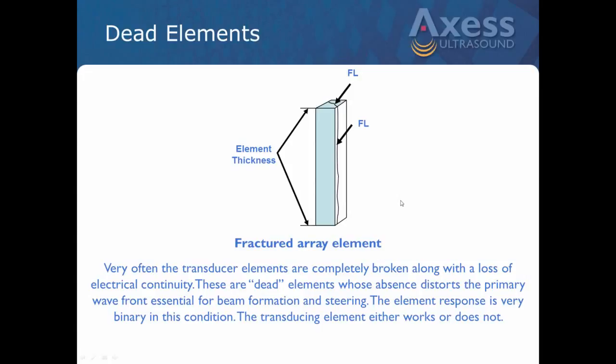Okay, I got another question here from George. Can we say that CMUT is better for abdominal probes? I would say, other than, as I mentioned, some of the sonographers' concerns, the clinical people's concerns about loss of detail because of the smoother imaging appearance and so on, I think that they would work well there.